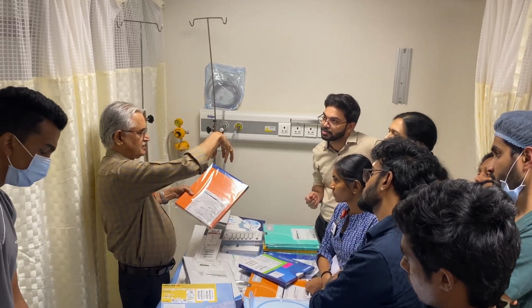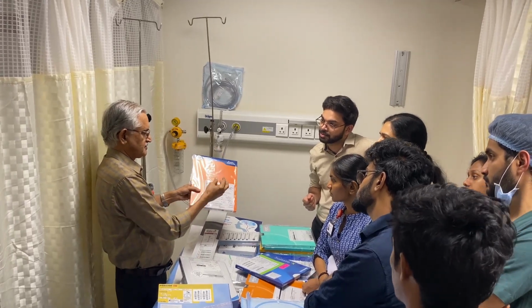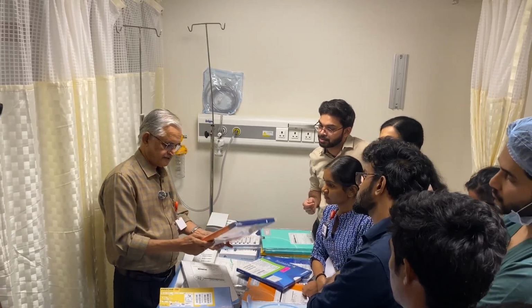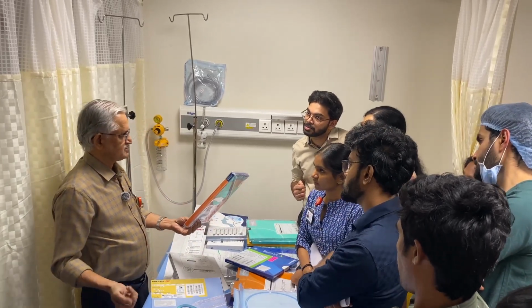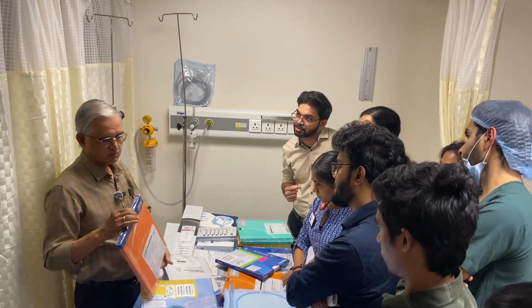It will be like an umbrella, and whatever small particles go, they will be captured there. Everything will be pulled out after the angioplasty is done. That is the protection device. Additionally, you can give a negative suction from below, so that the fragmented material will not go intracranially.